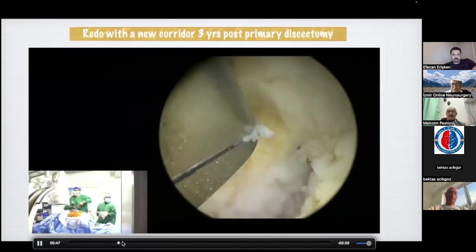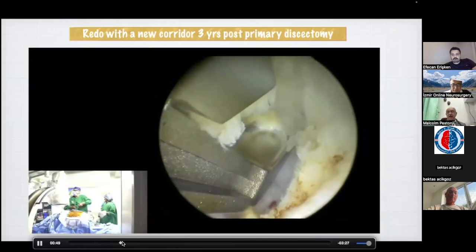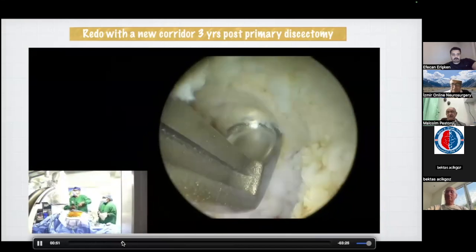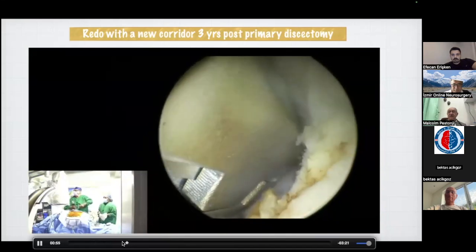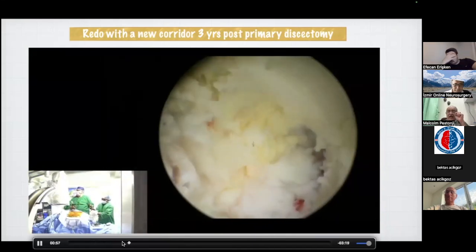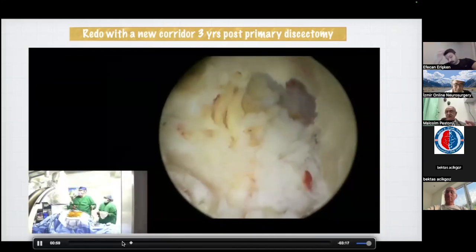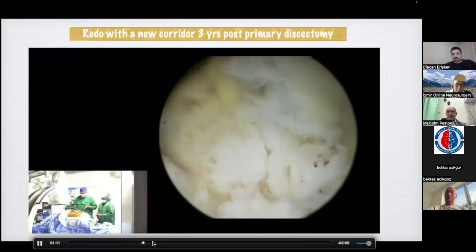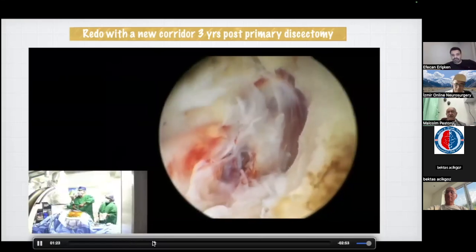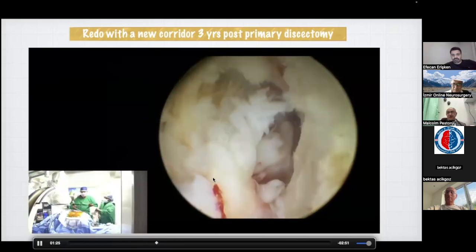So I start cutting into the IAP, transverse process corner, and I find old flavum there. See, finding some old actual anatomical tissue made my job so easy. So now let's start and explore further. We remove all that fibrous material, and you can see this root here.